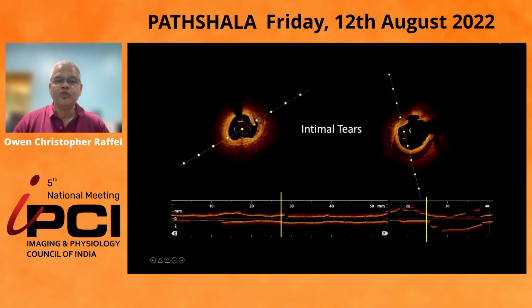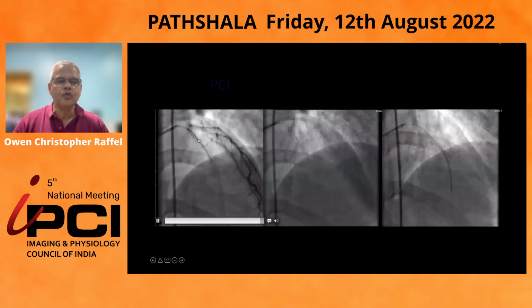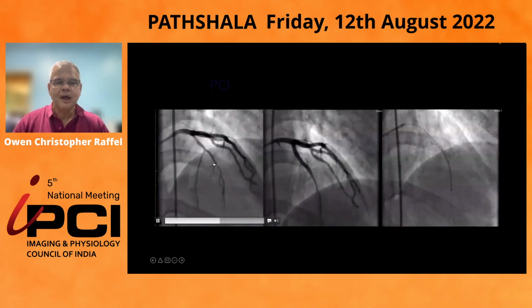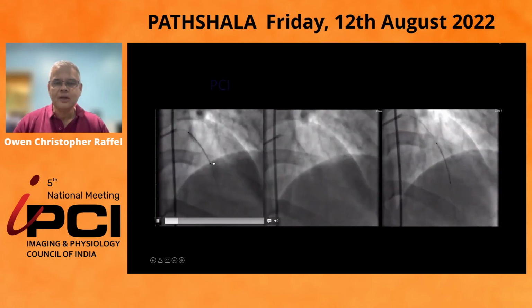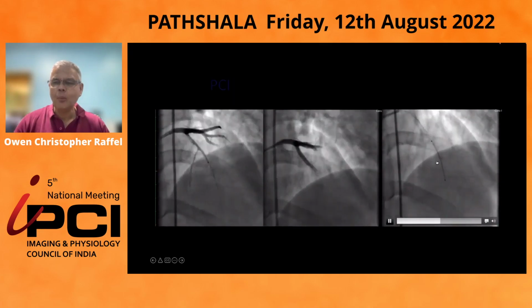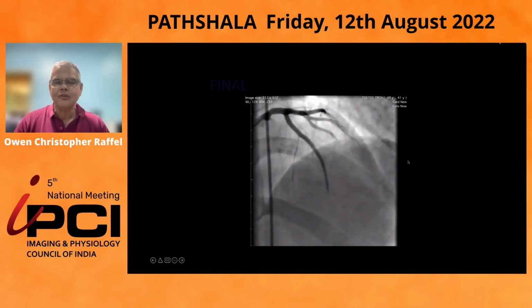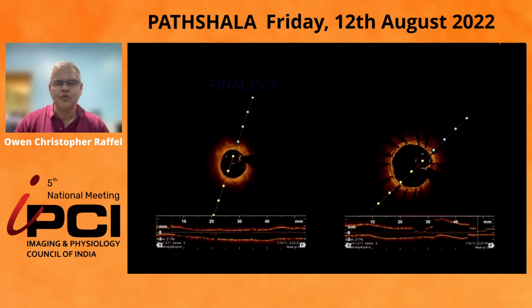Here, there were 3 intimal tears. Here are 2 of them, distal and proximal. So we decided to do with a proximal 3.0 stent, nominal inflation, followed by a distal stent 2.5, nominal inflation, no aggressive post-dilatation, with a very nice final angiographic result post-GTN.